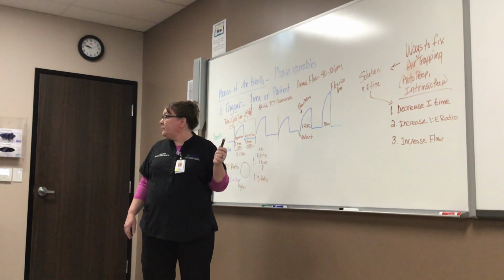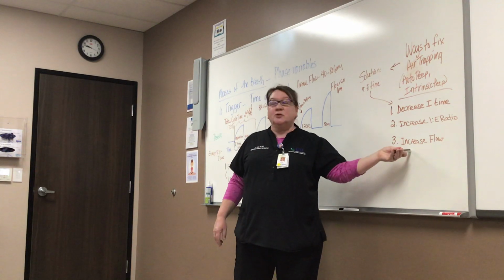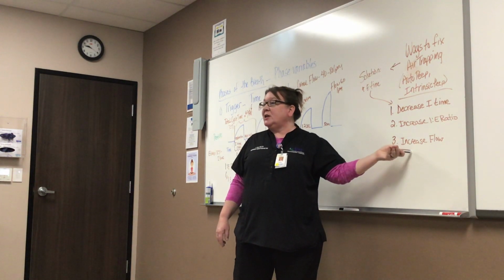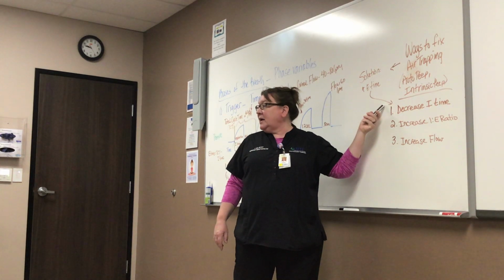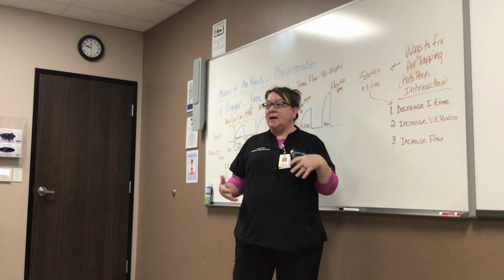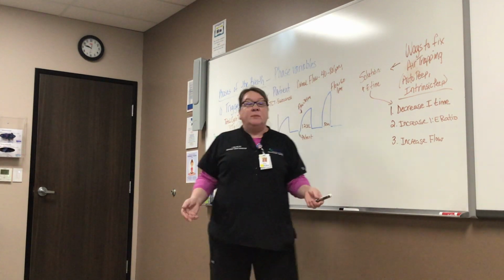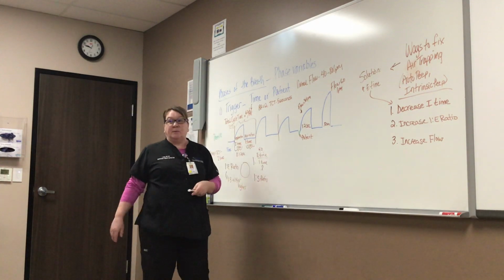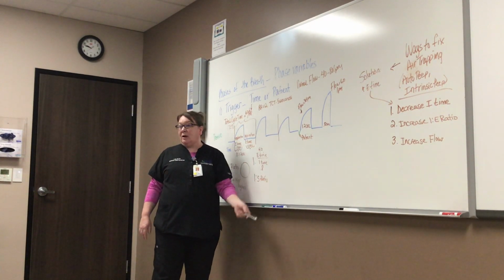Are there some ventilators where you can only change flow or only change the time? Yes. That's why we have different options here. Sometimes you can only change the flow, but by changing the flow, you change the I time. Sometimes you can only change the I time, but by doing that, you change the flow. So you're going to fix or set what you can depending on the ventilator that you're on. But that's how you can manipulate the inspiratory time. If you go down on your flow, you're going to make your I time longer.